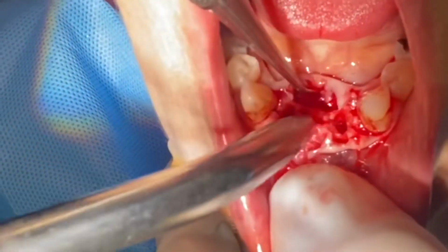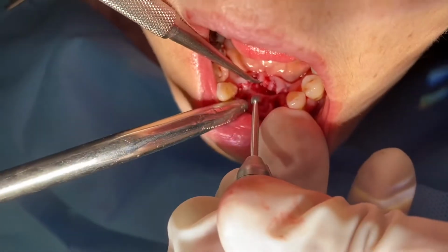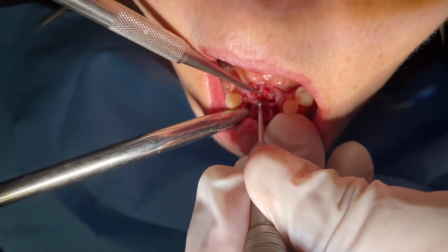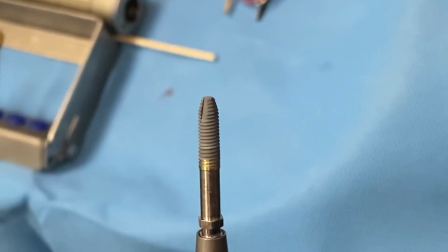Unfortunately, we don't have video of that, but we show you we're going to level the bone a little bit here to make that flat pontic, and we'll add a little bit of bone grafting in that area too. So we just took a small round burr and leveled down that middle bone a little bit to make it flat. So this will make it cleansable.